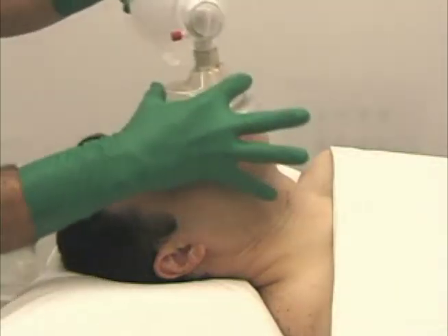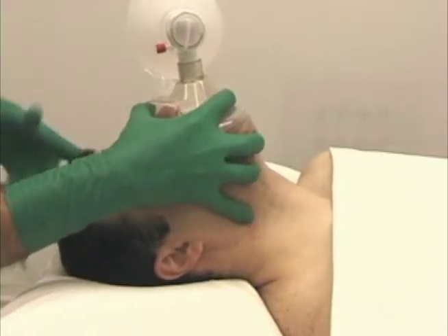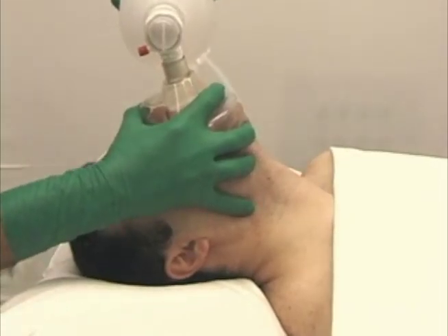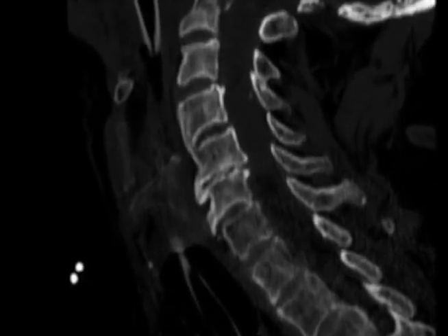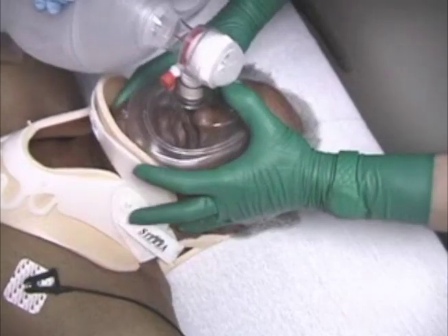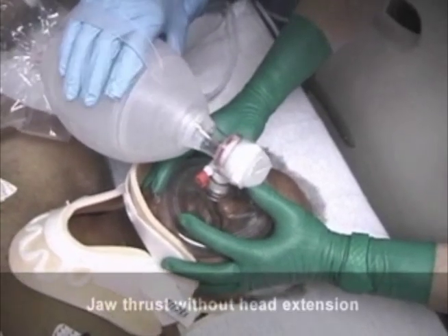Maintaining an adequate seal while extending the head, thrusting the jaw forward, and squeezing the bag with the other hand may require considerable manual strength and coordination. Extreme caution is advised in patients with cervical spine injuries, in which flexion or extension of the neck is contraindicated. In this situation, the jaw thrust maneuver alone, without head extension, is recommended.